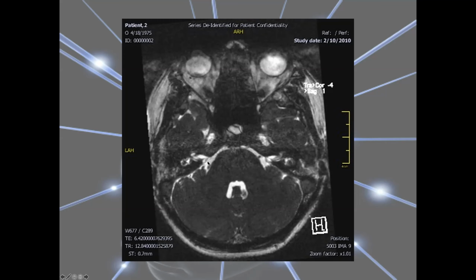Okay. The reason it's T2, we look at the fluid. We look for fluid-filled structures and we can see that fluid's in the eyeballs. So that fluid-filled structure is bright. So it's a T2 weighted scan. And if you remember right from the start, it's a T2 pathology weighted scan, because T2 showed pathology, because pathology has fluid and fluid is bright. Okay. So it's a T2 weighted scan.